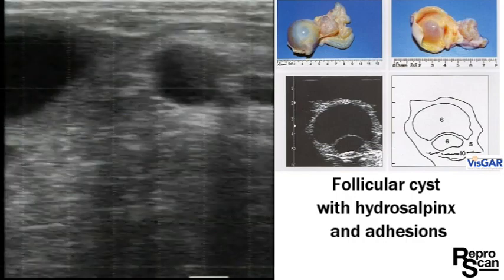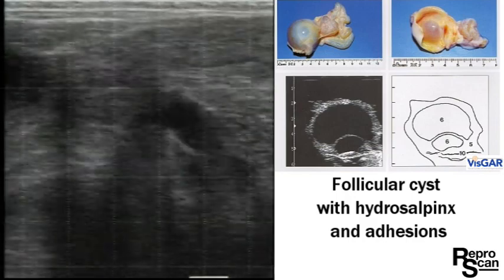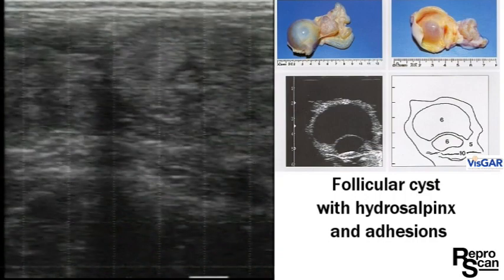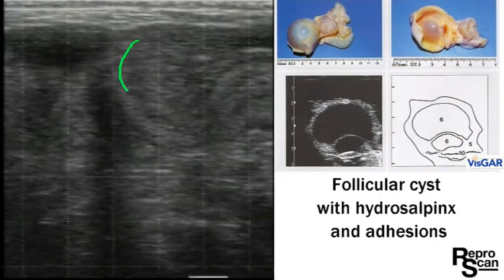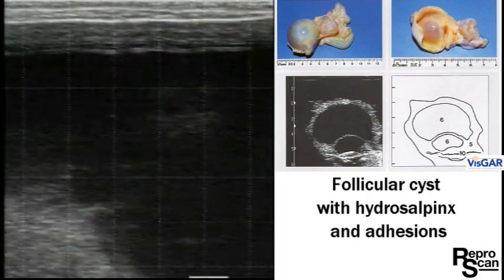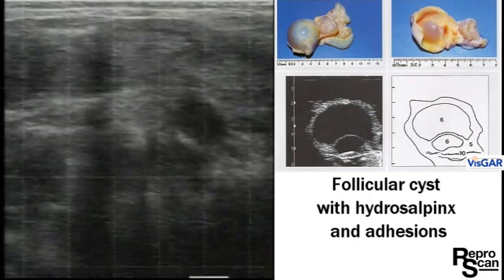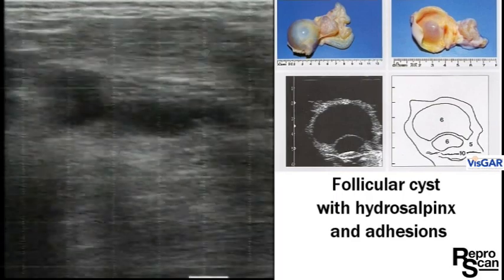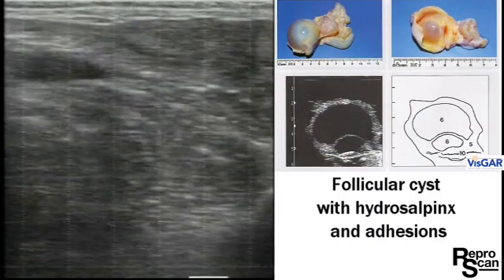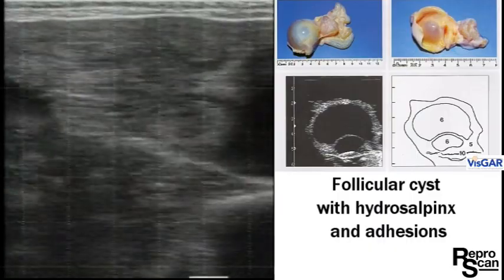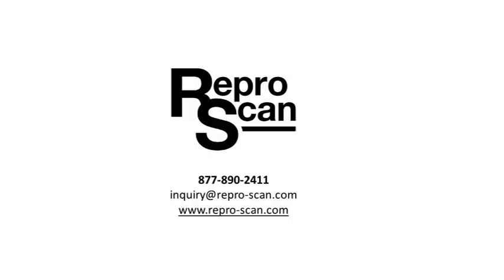There's a blood vessel there. Here's a very small, not-that-well-defined segment of open uterus — this animal wasn't cycling, I don't think. Lots of extra fluid right there. We just get a little hint of the bladder as we pull out.